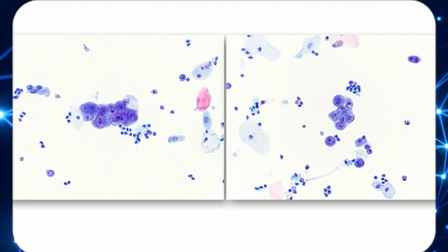Here, these cells are giving you a different morphologic appearance. The same cells, but the gland formation is missing. The cytoplasm is a little bit more abundant, a little bit more clear. NC ratio is still very high. And still a higher magnification here.